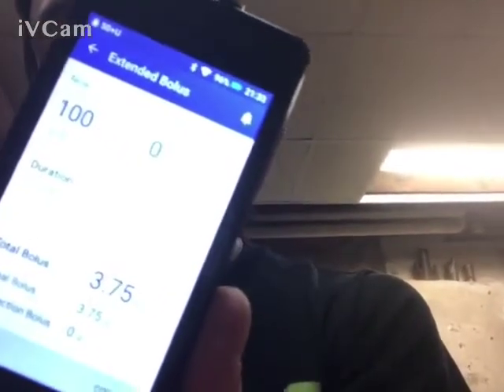Basically how this works is you're going to put the amount of whatever the bolus is — see how it's just 3.7. You're going to put the percentage of that that you want to be coming in later, to not be immediate. So for pizza, usually about 45 to 55% you want to be extended, because pizza is very slow acting. In this case, we're going to put 45.